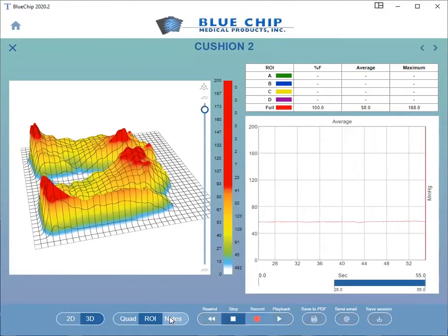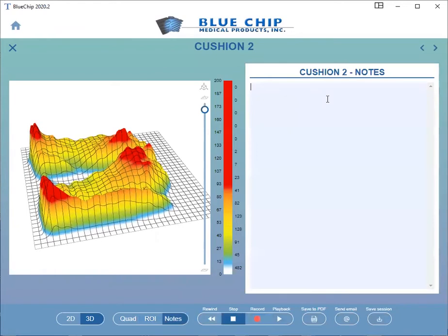By clicking on the Notes button at the bottom of the screen, you can make notes about each cushion. The slider to the right of the Pressure Map image will allow you to change the Z-axis scale of the Pressure Map.